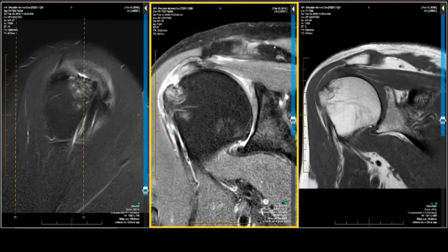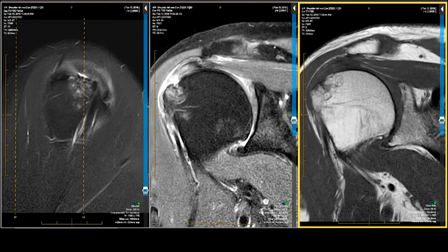So now I'm using this case to illustrate some verbiage, and I am intentionally, knowingly spending a lot of time on it.